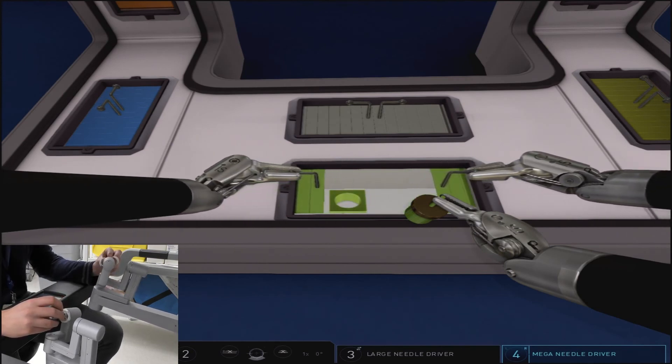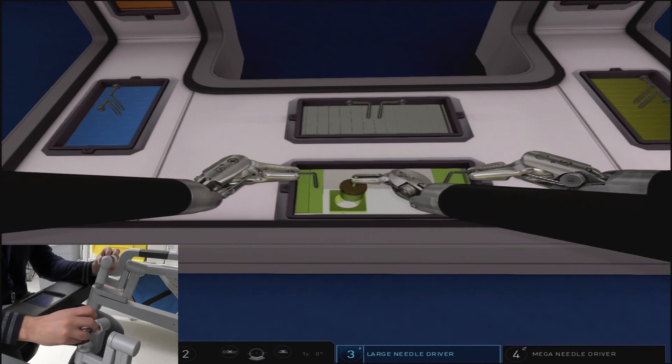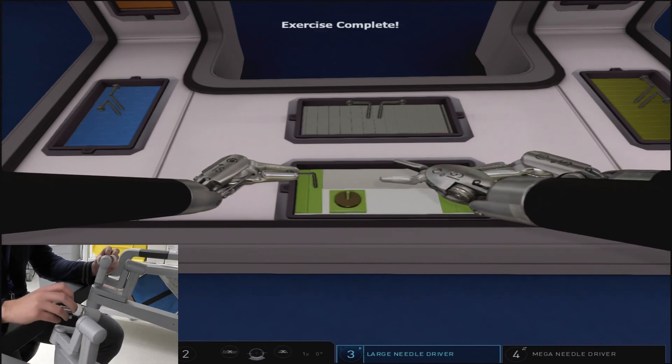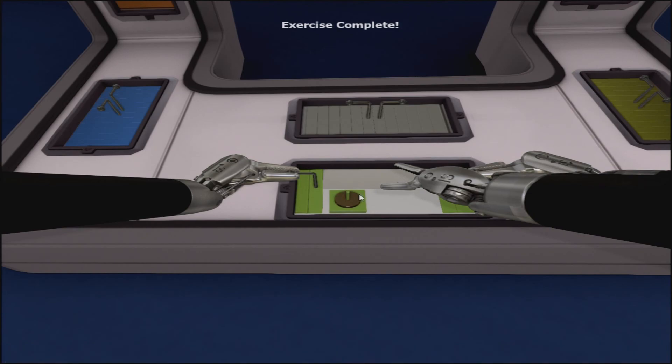A final note on excessive force: this exercise is more sensitive than the other three-arm exercises to over-excessive pulling on the door arms, so keep that in mind.